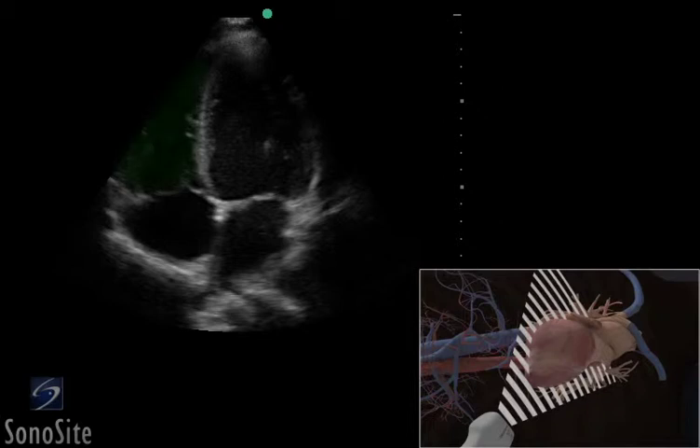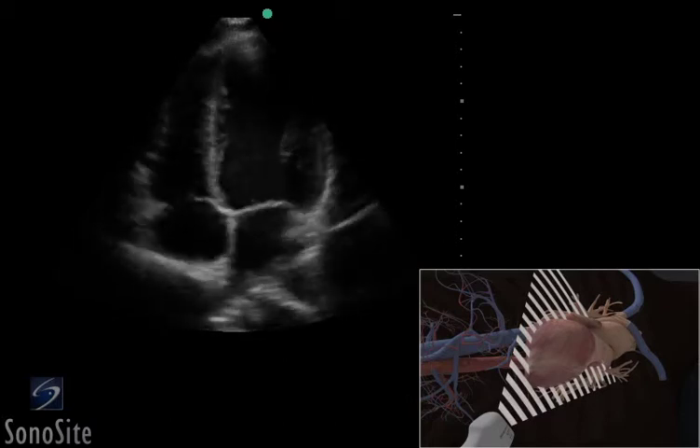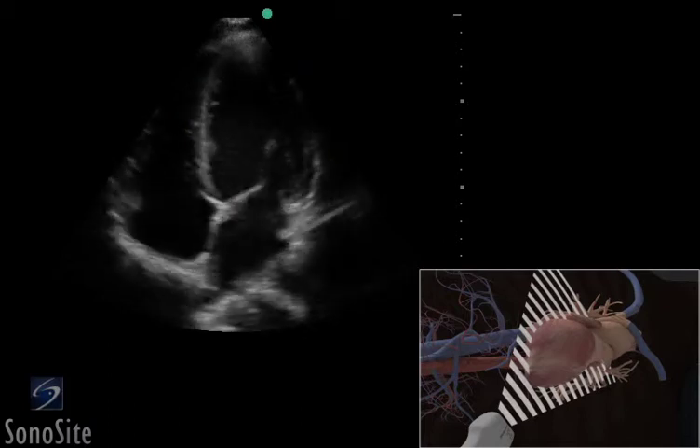This view is used to compare the size of the right and left ventricles and evaluate contractility. The right side of the heart, which is located on the left side of the screen, should be smaller than the left. The apical, septal, and lateral walls of the left ventricle are visualized in this view.